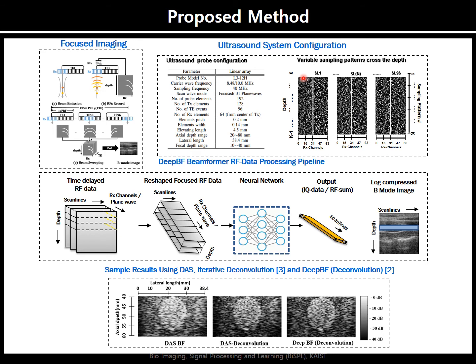For target images, we are not using direct simple deconvolution because conventional iterative methods used for the deconvolution are very slow and also require parameter tuning for different scenarios. Therefore, it is not suitable to use an iterative method to generate a large amount of data. Since image to image methods may require a large number of images, that's why we choose a different approach.